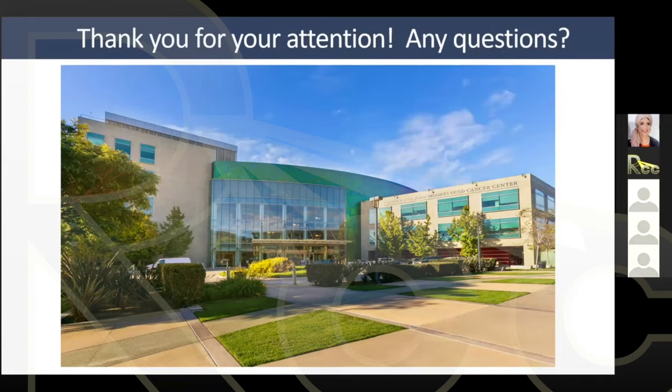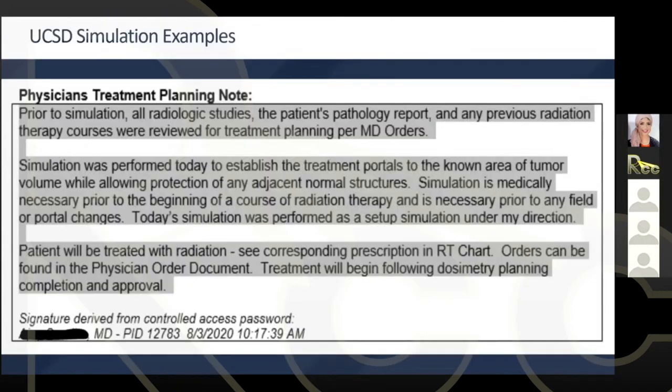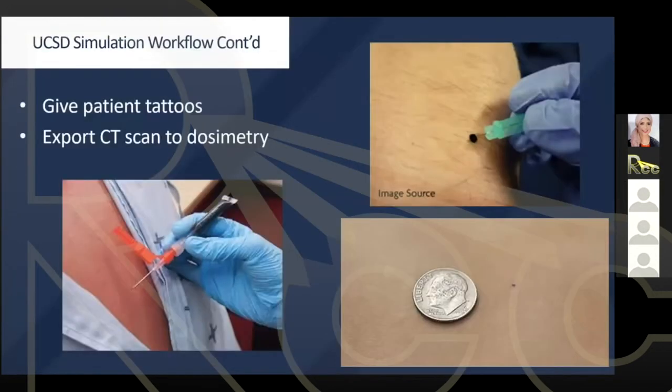Sounds good. I have a question from Winston. He is asking about the tattoo points because he said that he used to tattoo the patients in the 2D era. Yes. They are preparing to have the 3D. So he is asking about what we are going to tattoo. We tattoo the laser, we tattoo the intersections, what tattoo is.